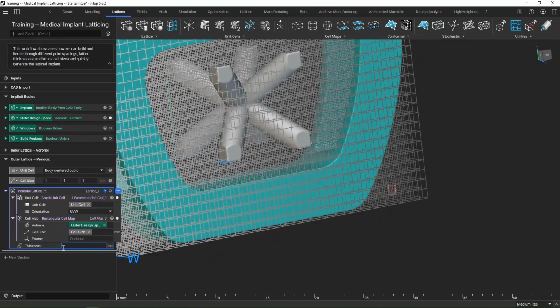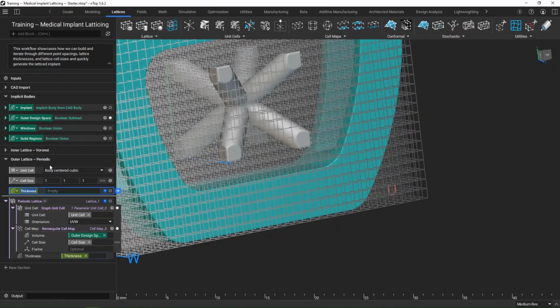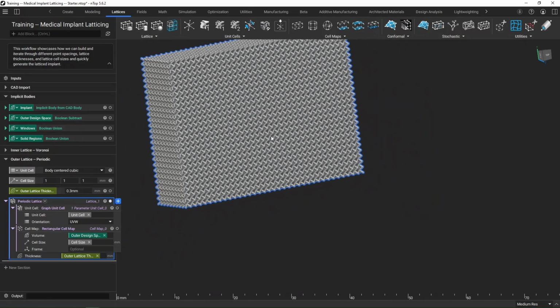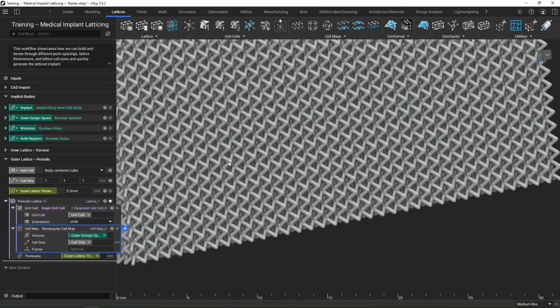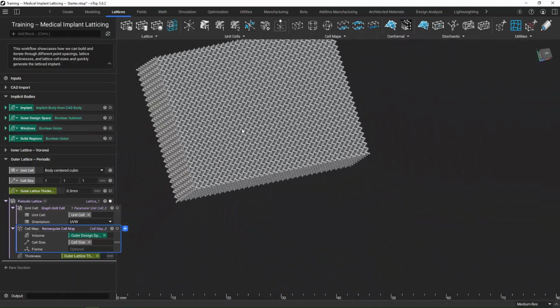And then lastly, we have thickness. So again, right click, make that a variable. That's going to be something that I want to play around with. But let's make sure we specify which one this is. So this is going to be our outer lattice thickness. And for that, maybe I'll go a little bit thinner than the last one. Let's just go with 0.3 millimeters. Make sure you're defining your units there, or else it might toss you an error. But if I isolate this view, again, by hitting I, then we see we've overpopulated, once again, that region, just because we're filling that entire cell map with that single unit cell that we saw before. So now we just have this big cube of our lattice structure.